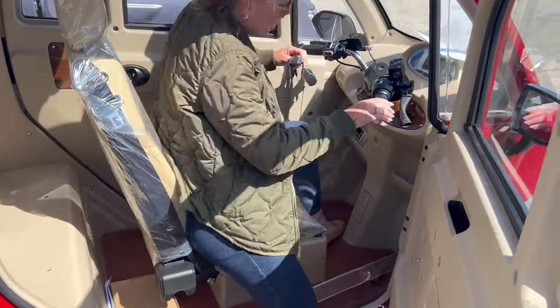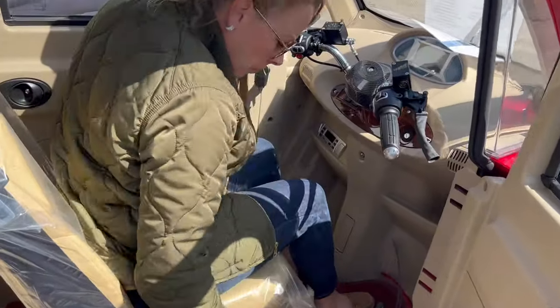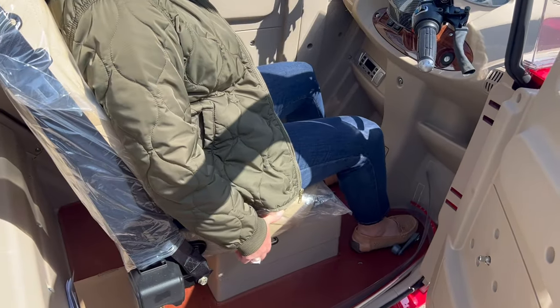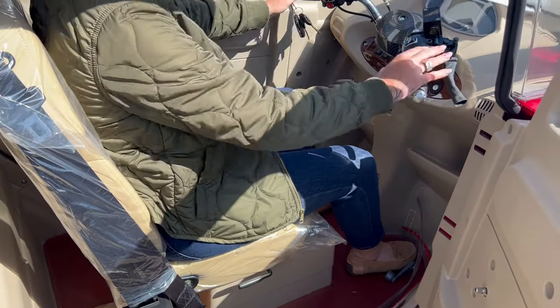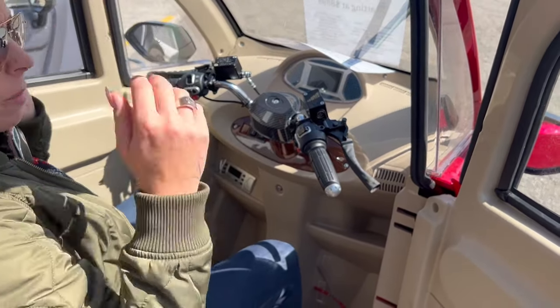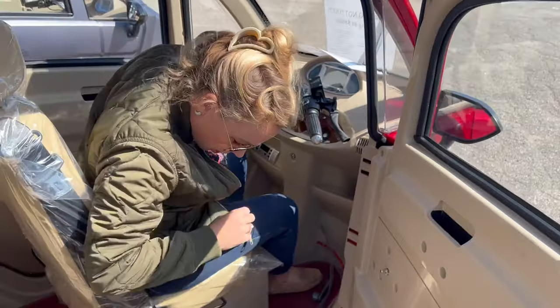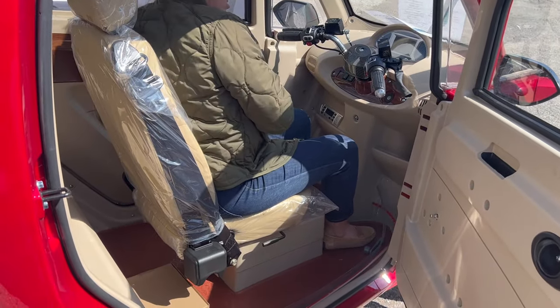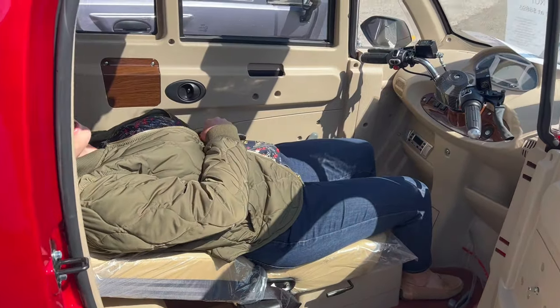So the seat doesn't go back as far as we would like, I'll be quite honest. You'd have to bend your knees if you're a taller person, but a six-foot person can go in here, no problem. Seatbelt. And then you've got your lever — oh, I want to take a nap!